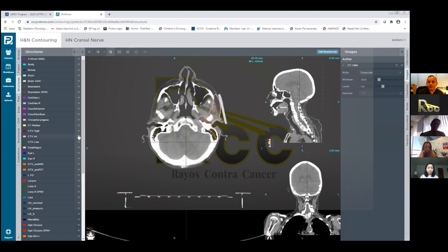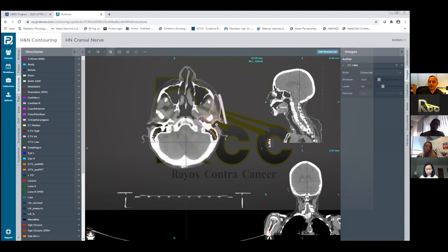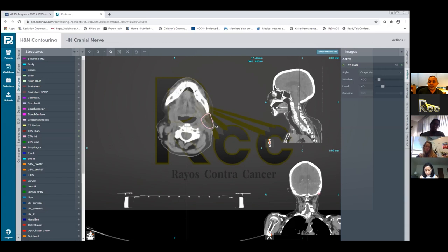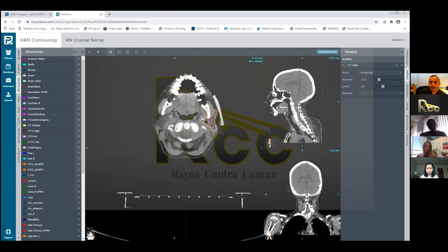The next volume is that intermediate dose cloud, where now I'm chasing the nerves and the remainder of the parotid gland. Let me start from the bottom so you can see. Here is me drawing; symmetry is everything, so I'm looking at the contralateral side because the gland has been excised. You can see my volumes of the parotid bed here, covering both deep and superficial lobes.